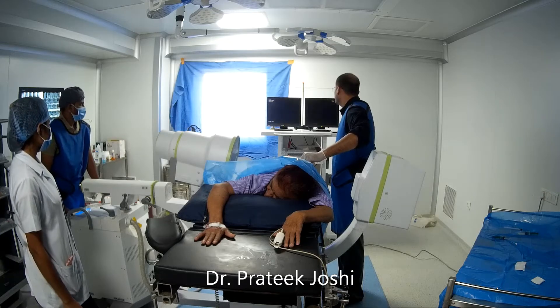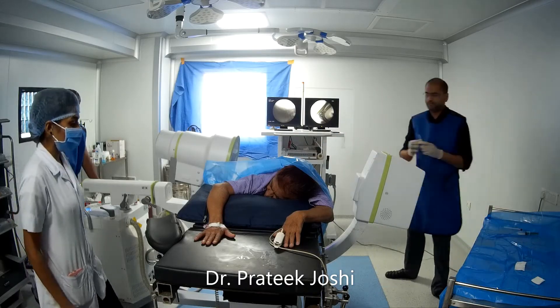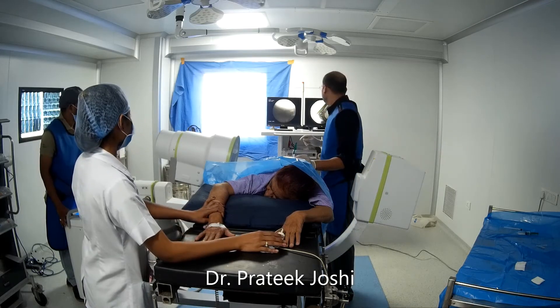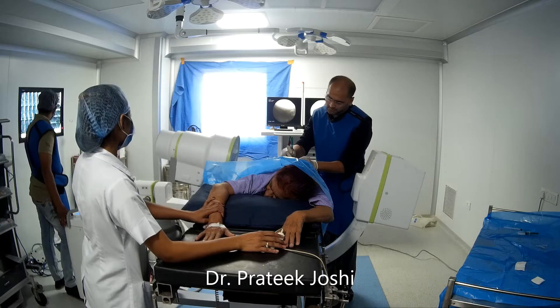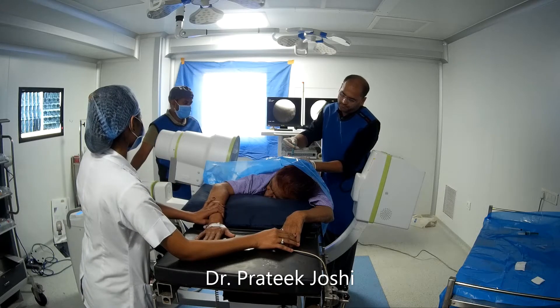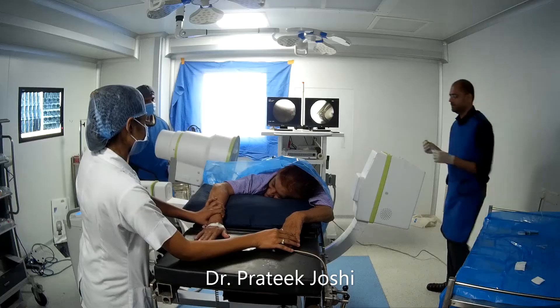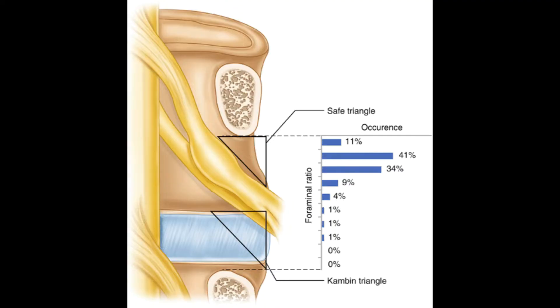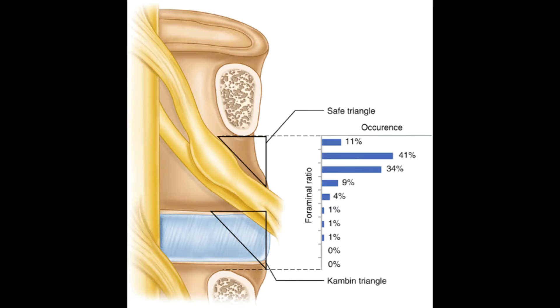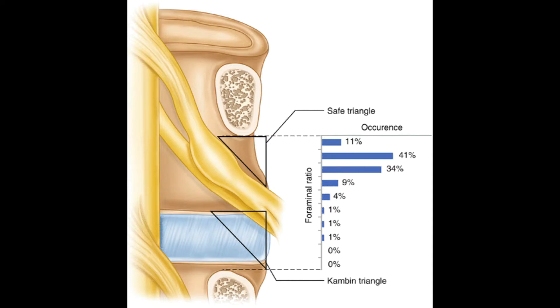Under IITV guidance, we identify the level which is involved as per the MRI scan and we infiltrate the skin with the local anesthetic agent. We are going to follow the subpedicular approach in this patient. The safety triangle in this approach is bound by the inferior surface of the pedicle superiorly and the exiting nerve root inferiorly.